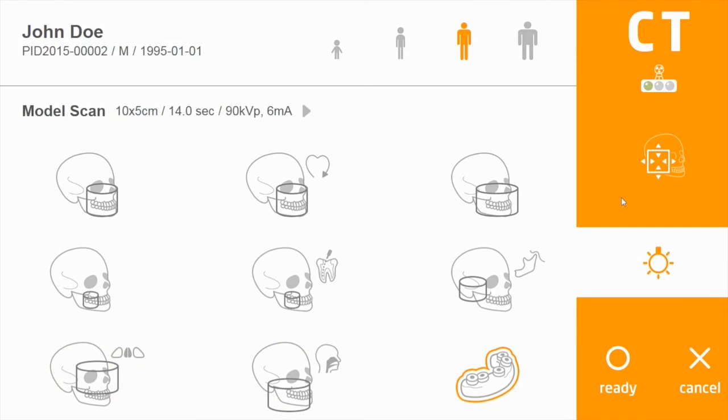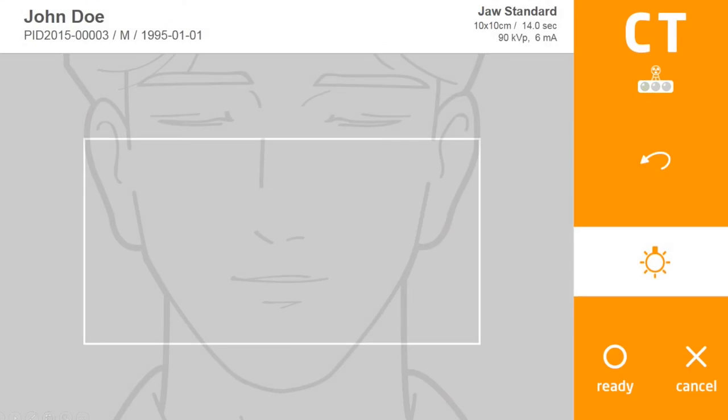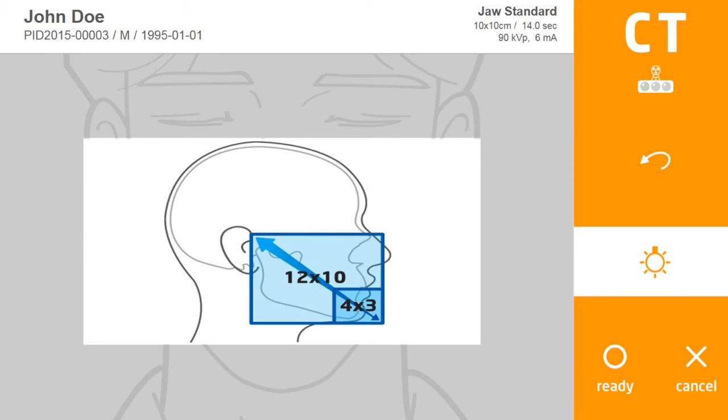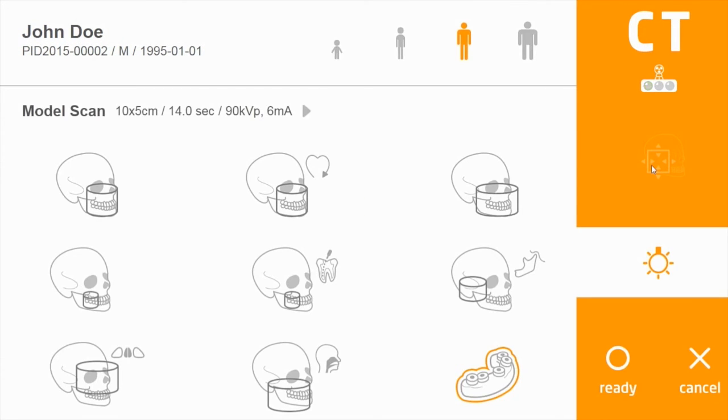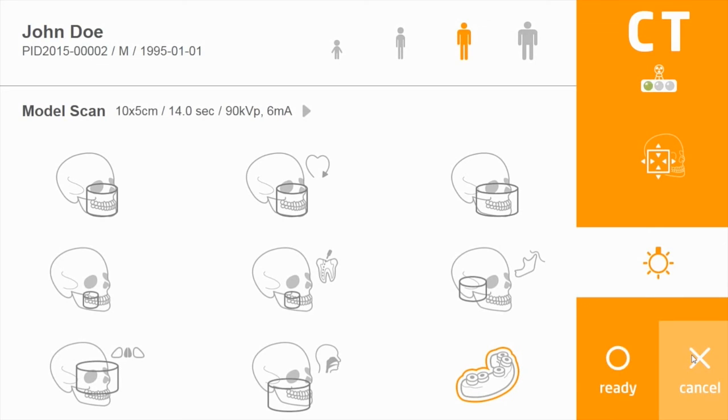In the orange section, you can adjust the field of view up to 12 by 10, either with the remote or touch screen. You can turn the positioning lasers on and off. You can ready the unit or cancel out of this interface.